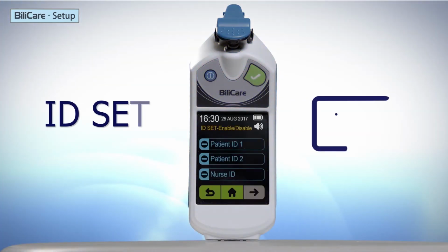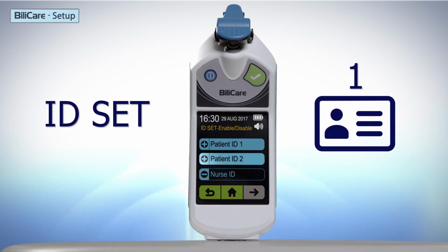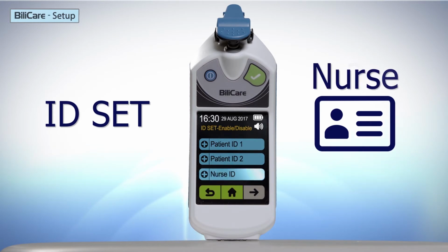ID set. 2 IDs may be defined for each patient and 1 for the nurse. An ID may include any number or nickname. The ID set menu determines which IDs will be required before each measurement. Patient ID 1, Patient ID 2, Nurse ID.